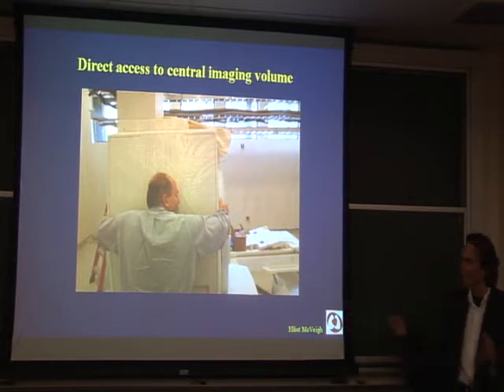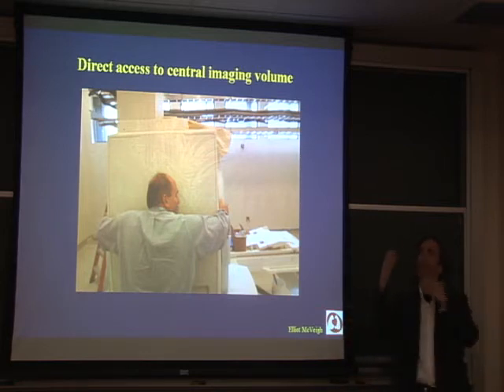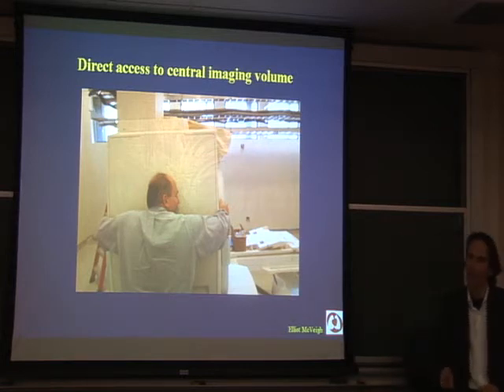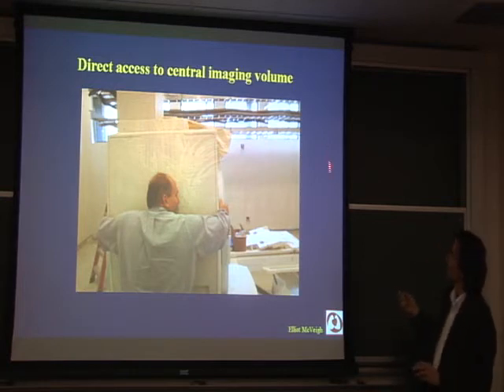And it's great. It's a 70-centimeter bore. It's a short little system. I jumped inside and looked around, and when you lie down, the top is about like this, really far away. Right, so it's a 3T, which would come out to about here.